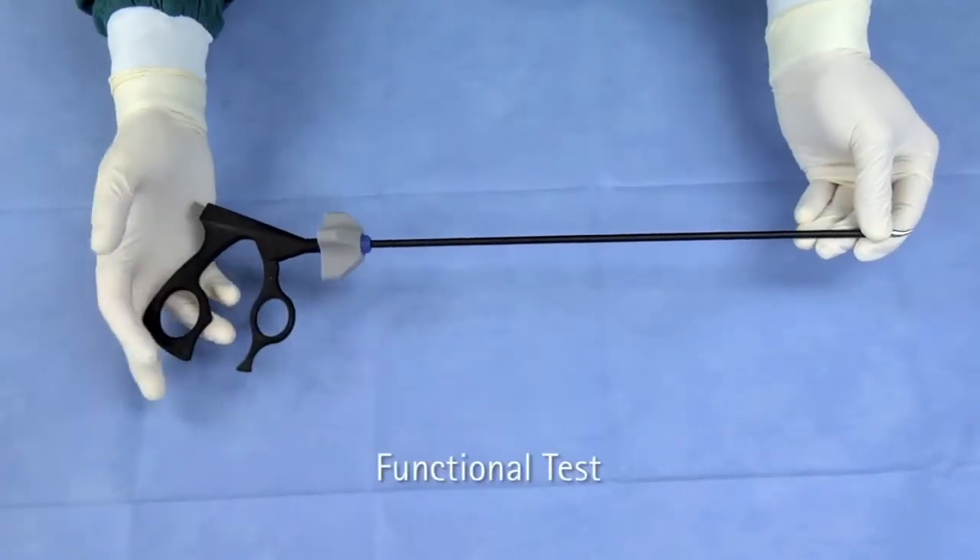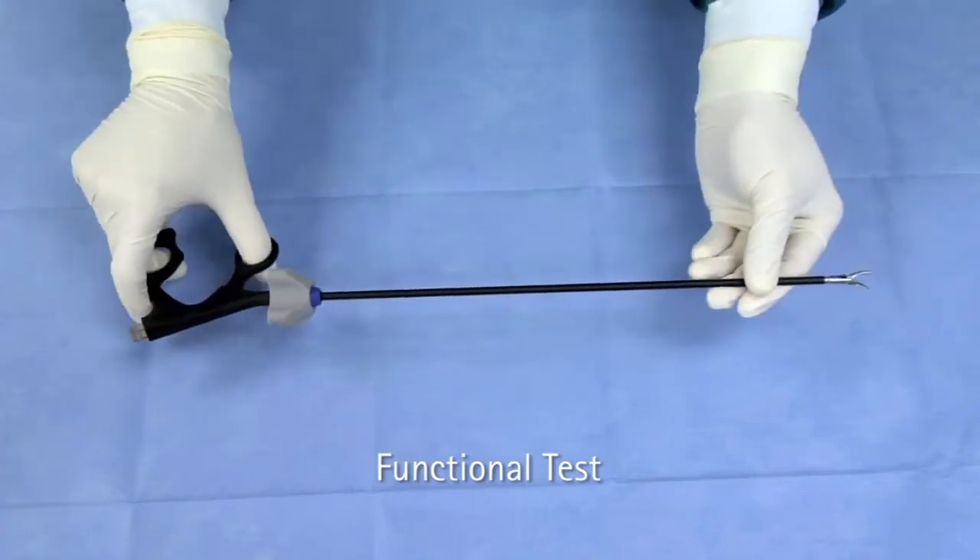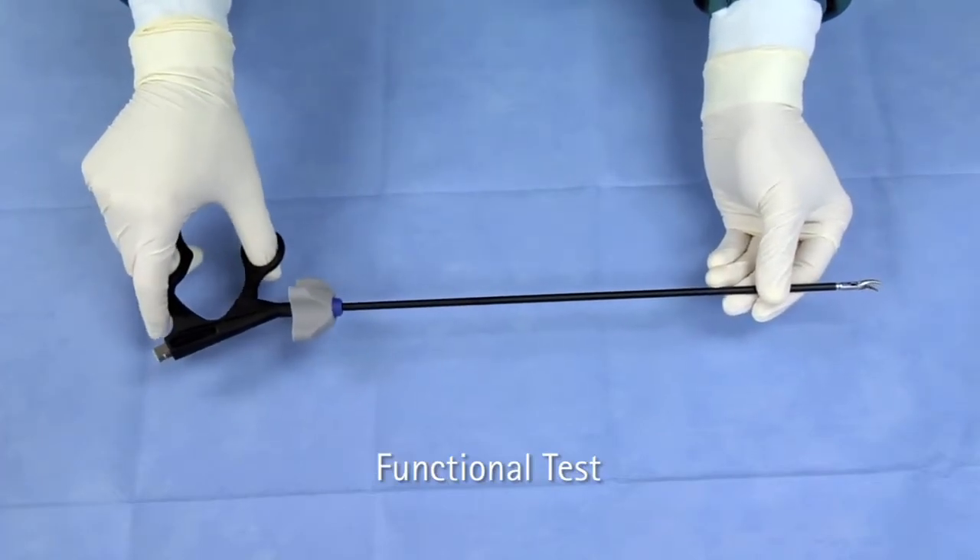Test the assembly of the instrument by opening and closing the handle. This will ensure the jaw is opening and closing with handle movement.